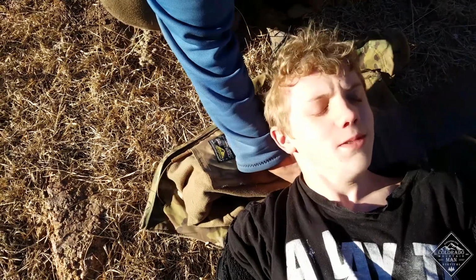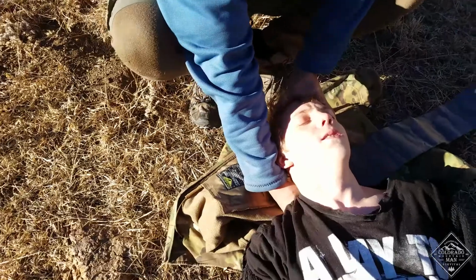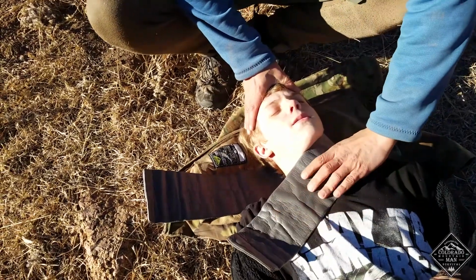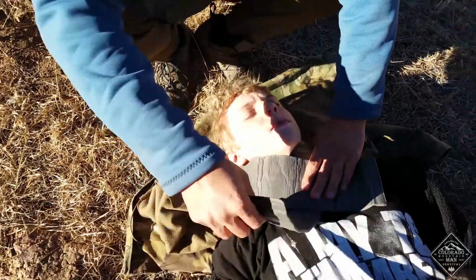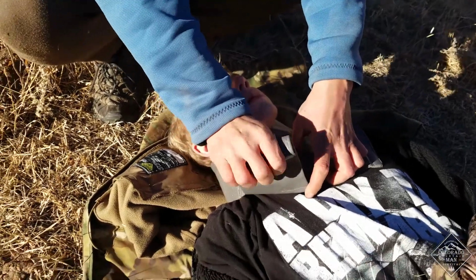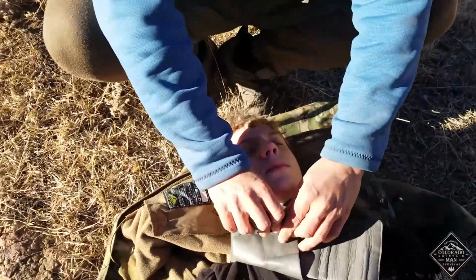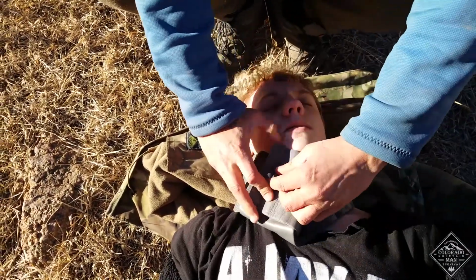Don't move your head. You're fine. No, don't move your head. Relax the whole way. Good. So you're going to have to reach back there and fish it a little bit. You know, just do the best you can. This really is a two-person job, but do the best you can. So one comes here, and one comes here. So this folds up. And then this one, and that one folds over top there.